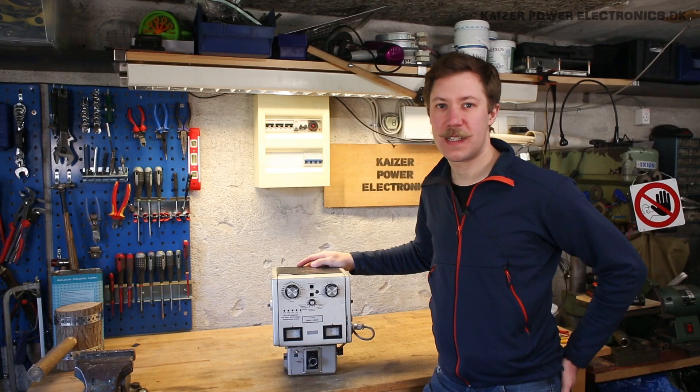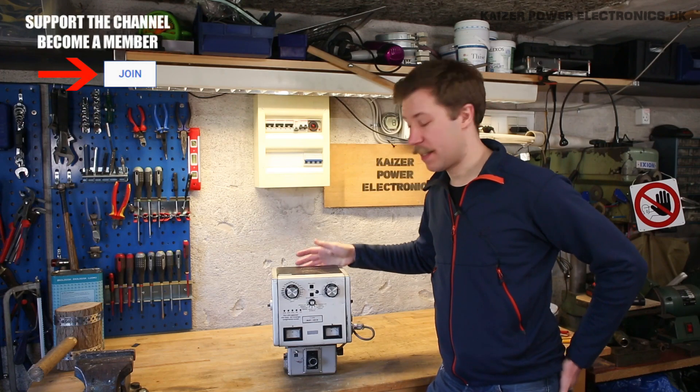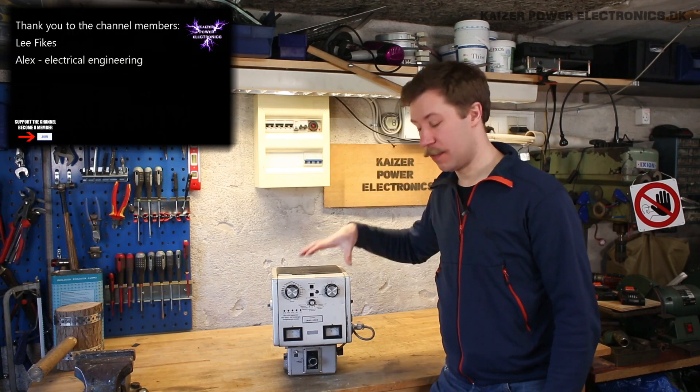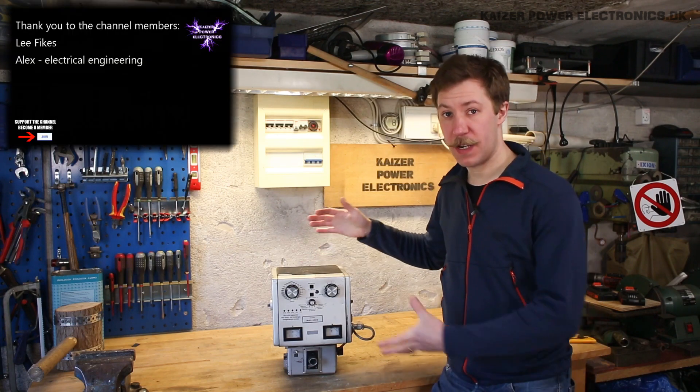Hi all, Mads Barnkopf from Kaiser Power Electronics here. Today we're taking a look at this Showa Portable X-Ray unit. It is the model or type SP-103, made in Japan.